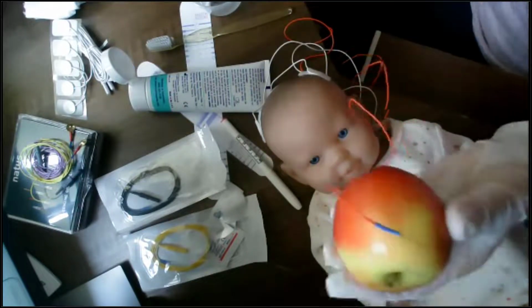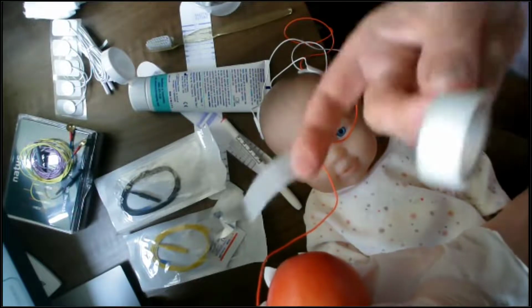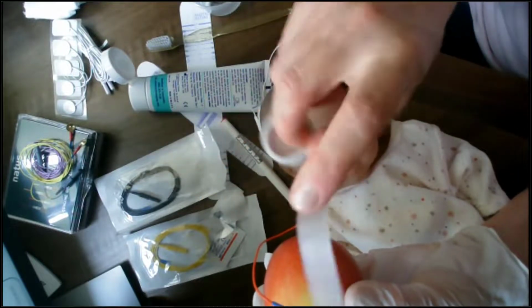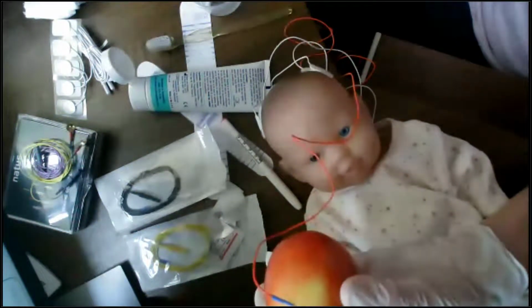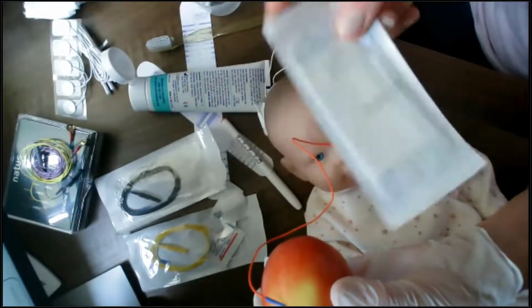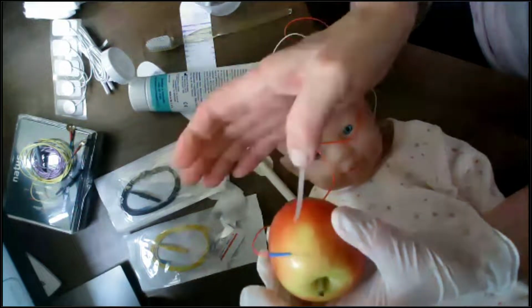So the next thing I'm going to do is secure it. Now, remember I mentioned you can use tape, so I've actually got a roll of tape here. I could use tape if I wanted to, but I have to say my personal preference is steri strips, because steri strips are very sticky and they're very small as well.